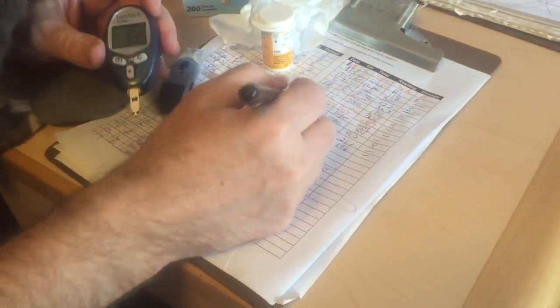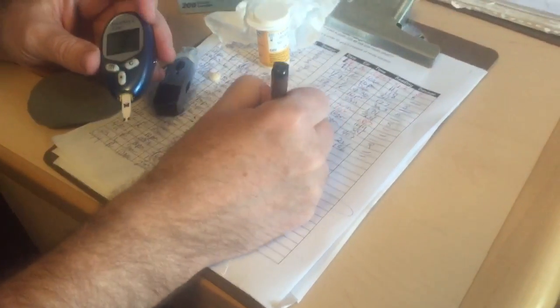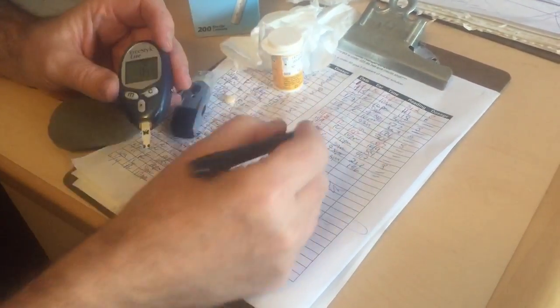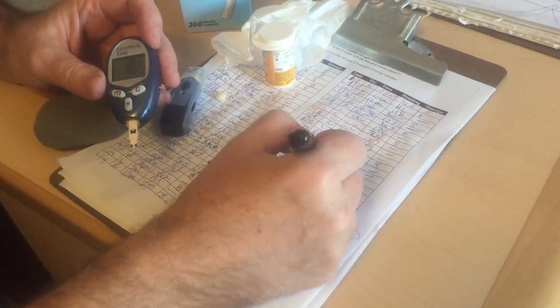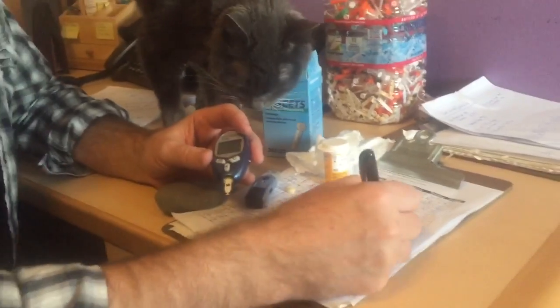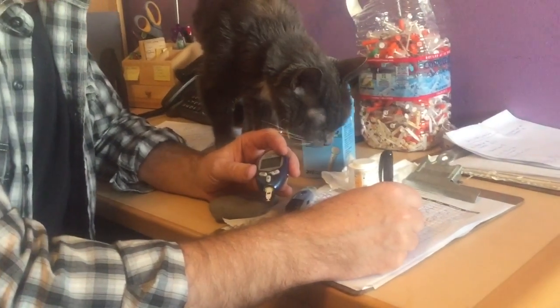Once it's done — 165 — we just write it down on a piece of paper. We write down today's date, which is 1/15. We use the right ear this time; sometimes we use the left. We just want to make sure we don't use the same one all over again. We write the time — we do one in the morning and one in the evening, so let's say it's 9 a.m.